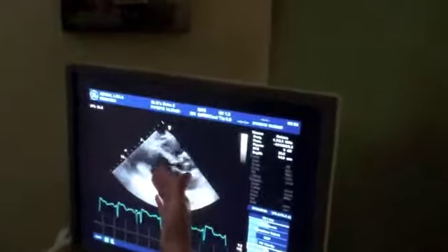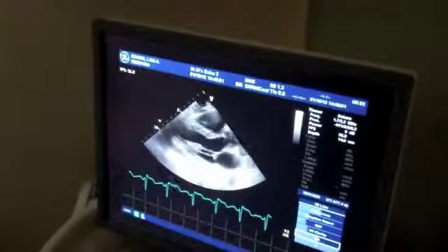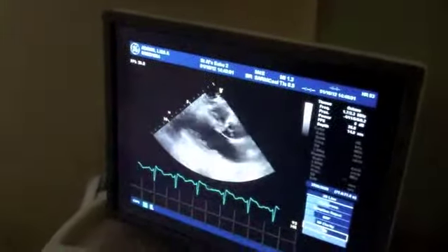It's going to go into the ventricle. When it squeezes, it pushes it out the aortic valve, and then that's how the blood gets distributed to our body, so we can eat, walk, talk, breathe, all that stuff. Live. That's good.